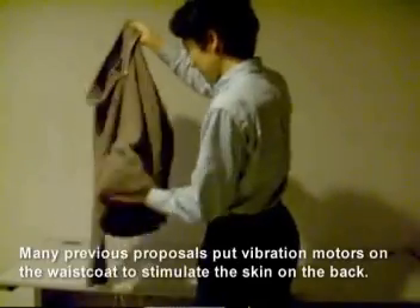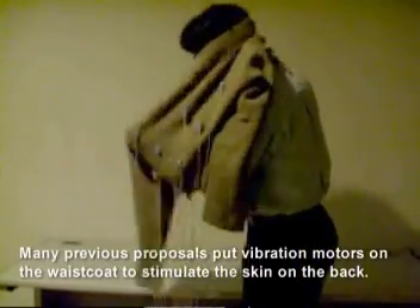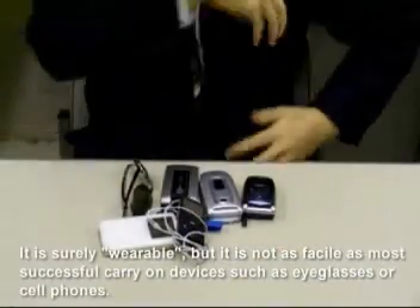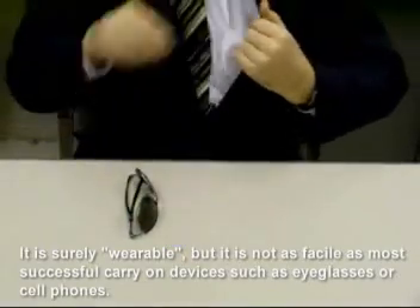The other reason concerns the region of stimulation. Many previous proposals put vibration motors on the waistcoat to stimulate the skin on the back. It is surely wearable, but it is not as facile as most successful carry-on devices such as eyeglasses or cell phones.